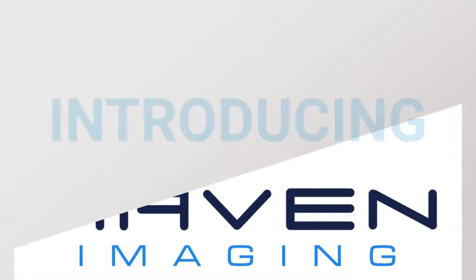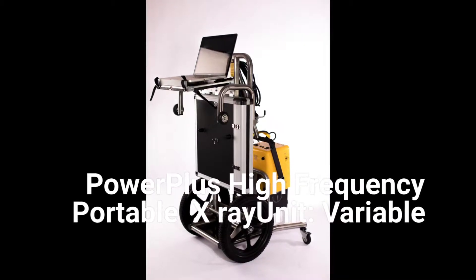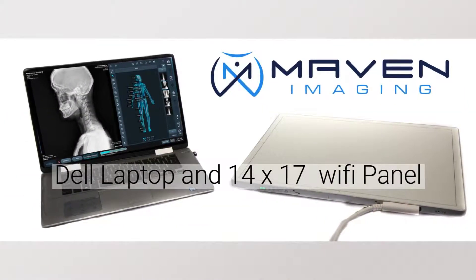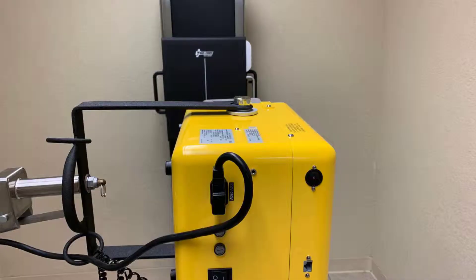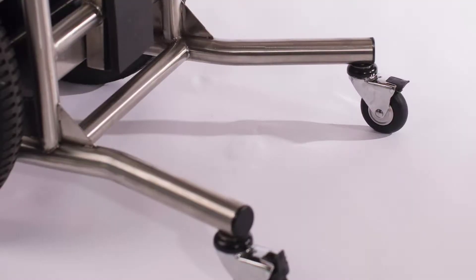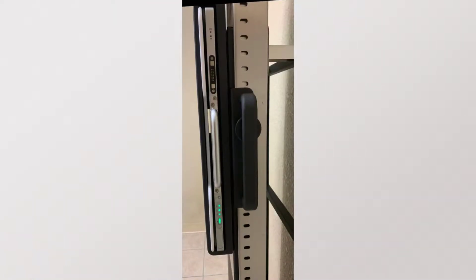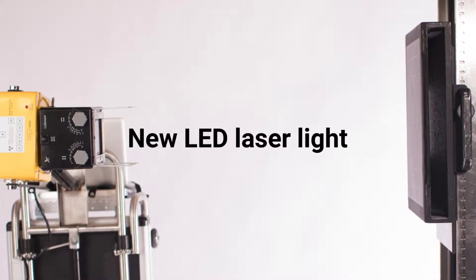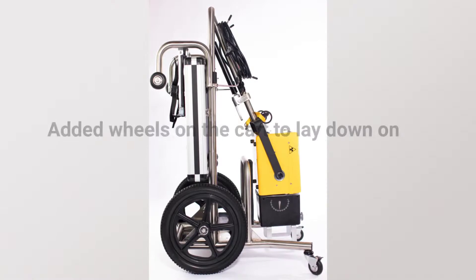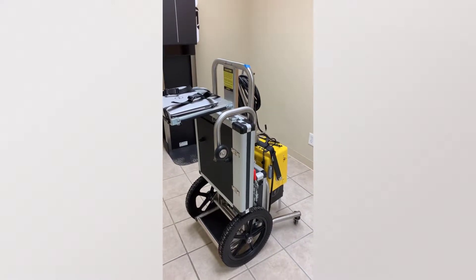Thank you for joining us. This is the MIM X-Ray HF120 Hi-E mobile cart.